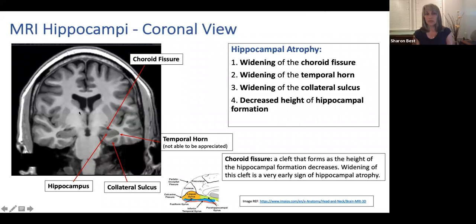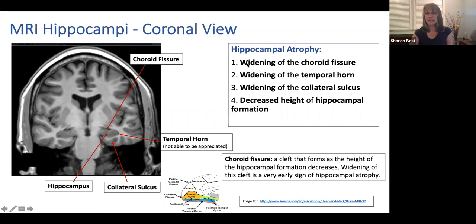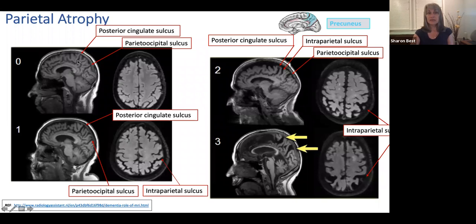Our best view to look at the hippocampi is the coronal view. On the coronal view, we pay attention to the choroid fissure, the temporal horn position, the height of the body of the hippocampus, and the collateral sulcus. The choroid fissure will widen and coalesce with the temporal horn, and we may also see widening of the collateral sulcus as the parahippocampal gyrus atrophies. For parietal atrophy, we want to pay close attention to the posterior cingulate sulcus and the occipital-parietal sulcus, as well as the intraparietal sulci on the axial view.